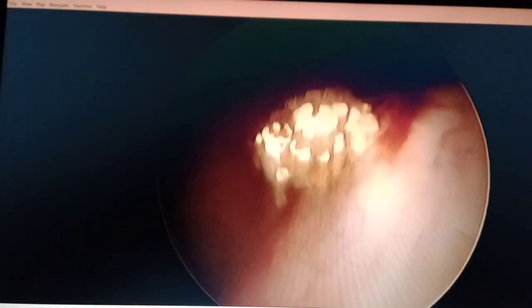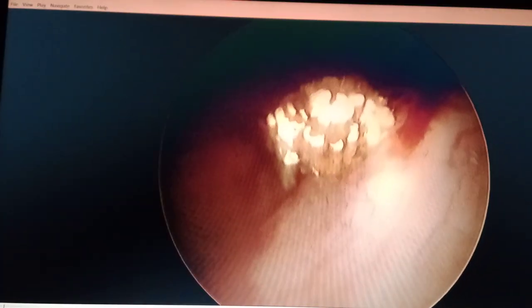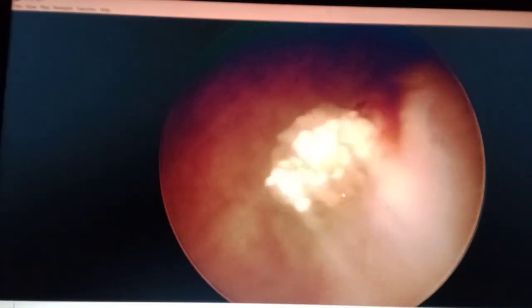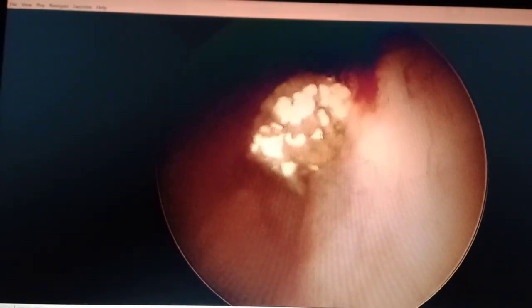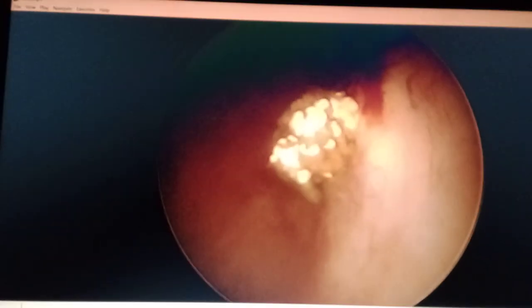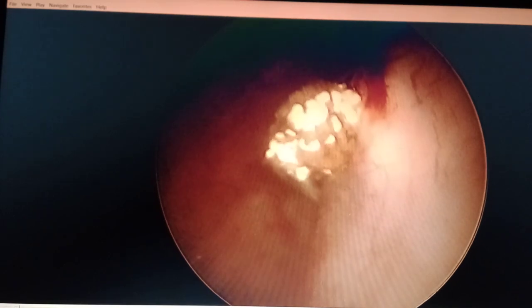Here you can see a stone is just projecting inside the urinary bladder lumen through the left ureter-vesicle opening. This is the stone — if you can appreciate the cursor, this is the stone. This is a cystoscopic finding; we are performing cystoscopy at present.